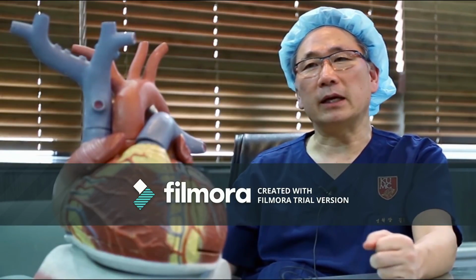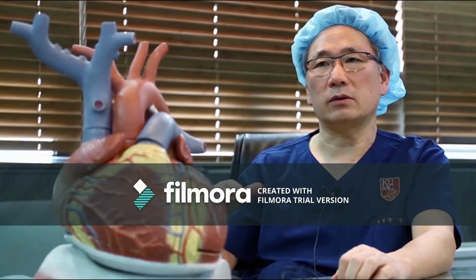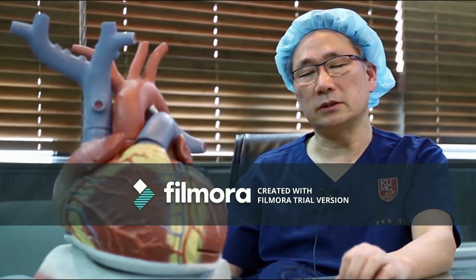Mapping of atrial tachycardia is the endpoint for the persistent AF population.